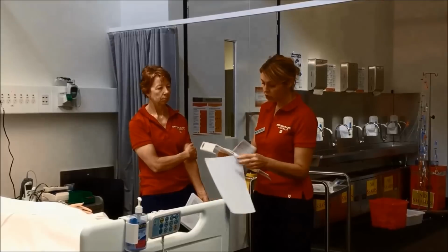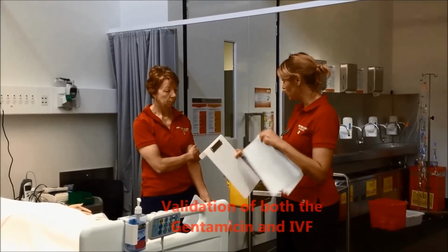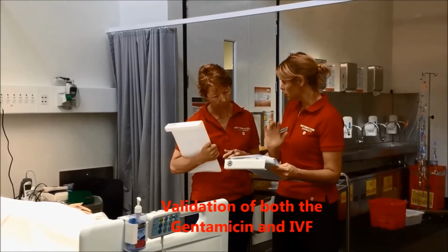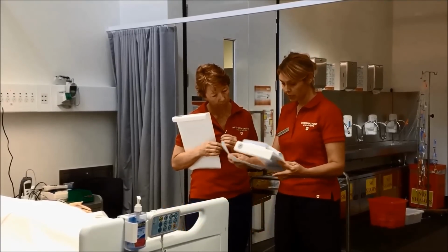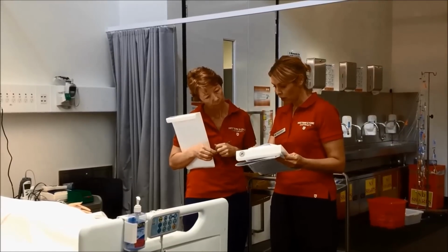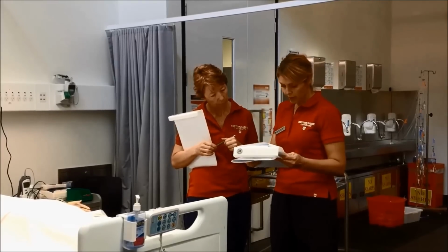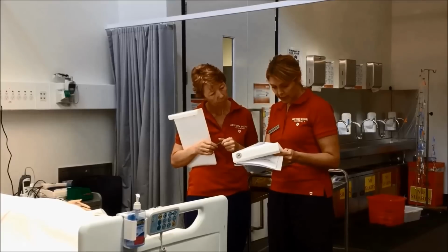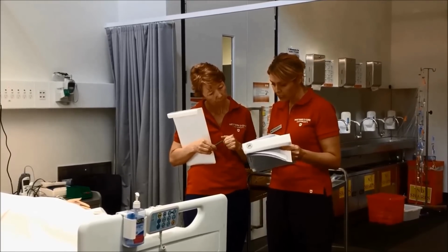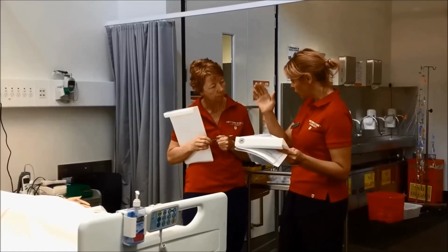Okay, no worries. I'm just going to do a validation of my drugs, please, so you'll be able to help me with that. So I just want to do validation of both my drugs, so the normal saline and the gentamicin. So here we have Mr. Lockyer. His date of birth is 1st of 3rd, 45, 895-689, and I've checked that with him and he has no allergies, so that's all correct. Biodata is correct. It's today's date, it's normal saline. We're giving 500 mils over 4 hours. However, in the patient notes it states I'm putting it at 100 mils and giving it over 1 hour.